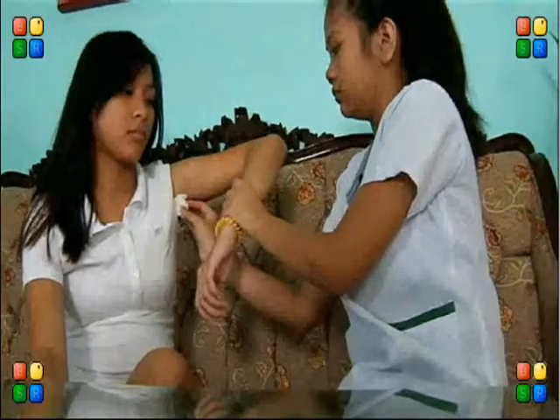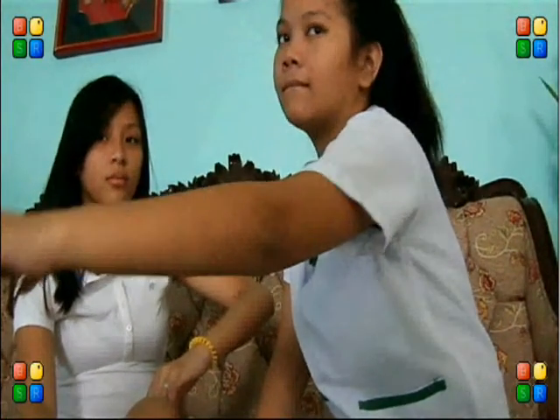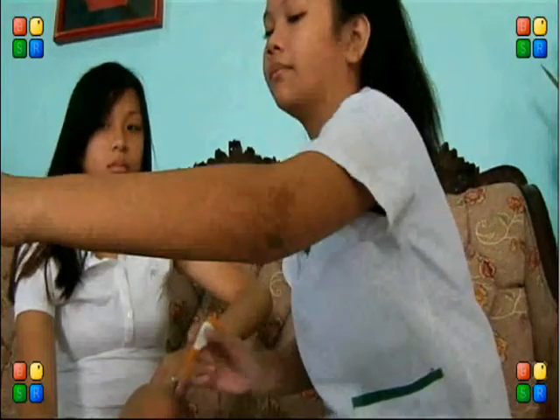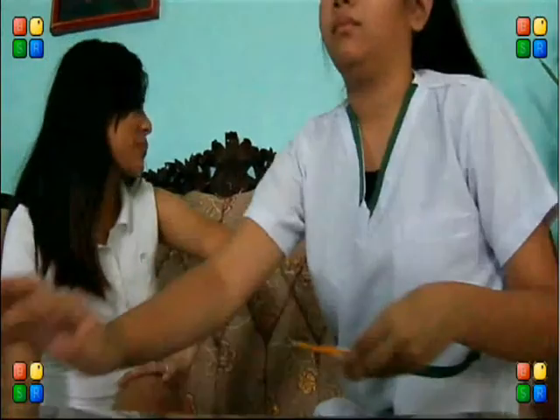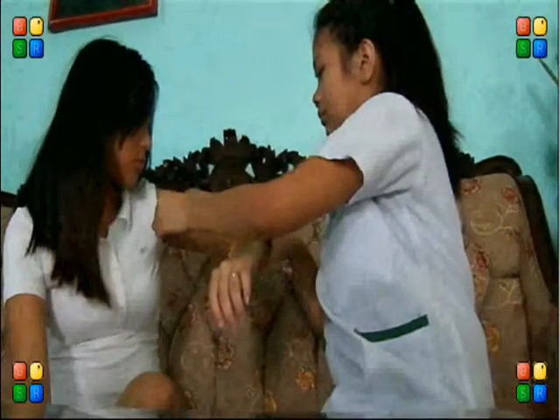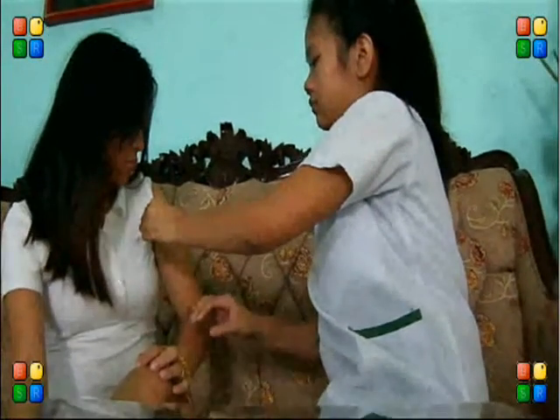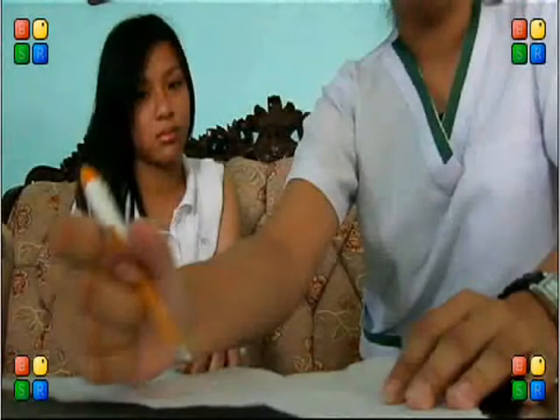Do not drop the thermometer. Put the bulb in the center with the end slanted towards the body. Read and record the temperature.